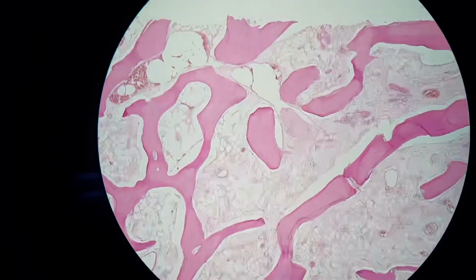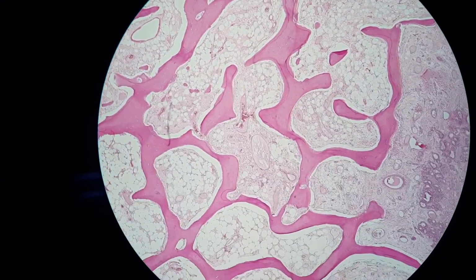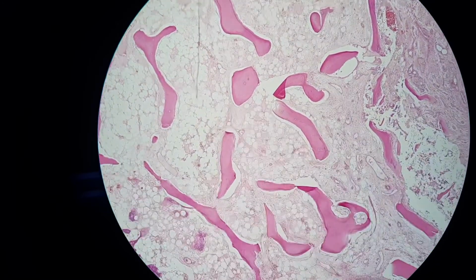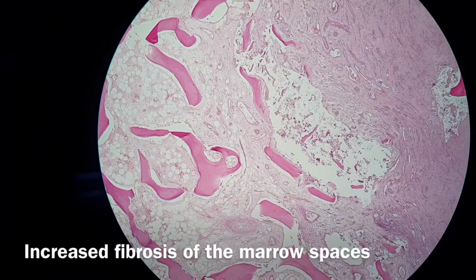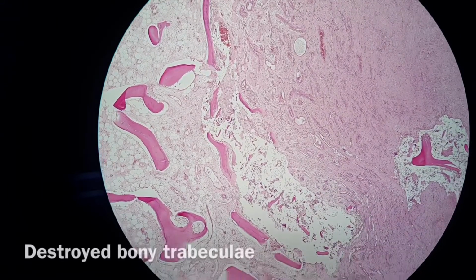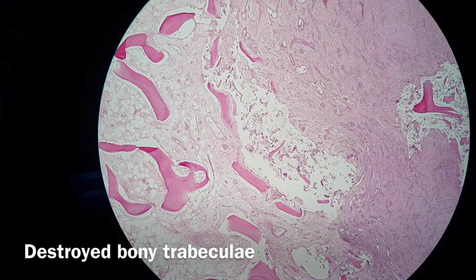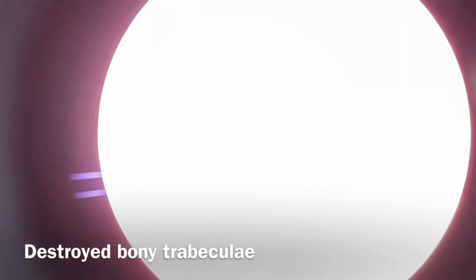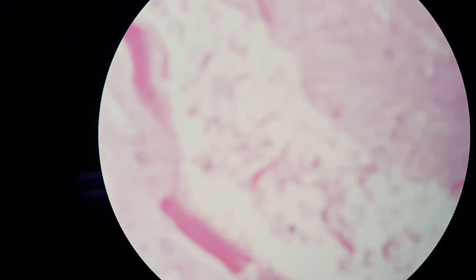So as you go along, you can see the majority of the marrow spaces is replaced by fatty tissue, and at this point you can see there's increased fibrosis here, and there are some bony trabeculae that have been destroyed or become necrotic here, which signifies something. So we have a look.